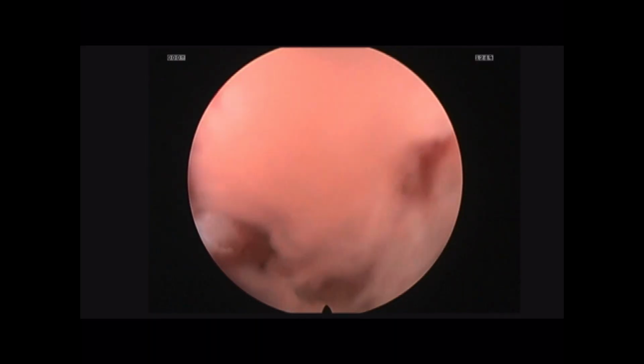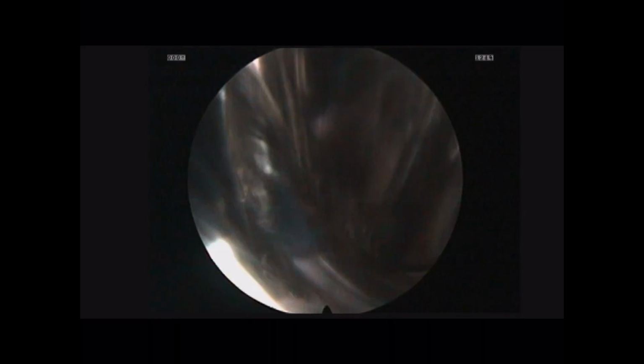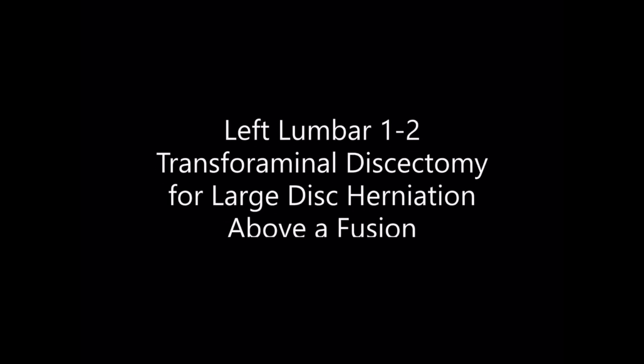Some of the graspers seen are more aggressive than others, and others are angled and flexible. We also utilized a blunted ball probe to dislodge any loose pieces. Here you see a disc fragment being removed. This fragment measured about 4 millimeters, and the patient was able to voice near instant improvement of their preoperative symptoms.